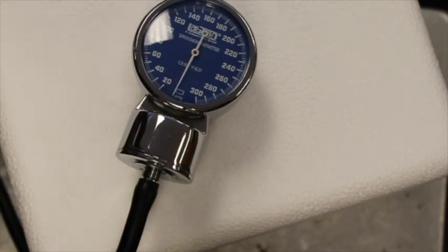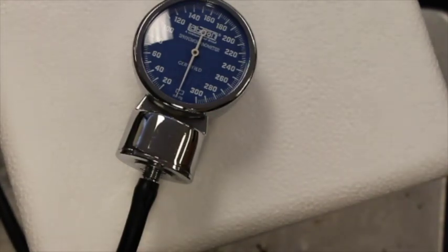Okay, so I want you to record those values. That is blood pressure at rest. Okay, now I'm going to go actually exercise for two minutes. And we'll see. And we'll do it again after two minutes of exercise.